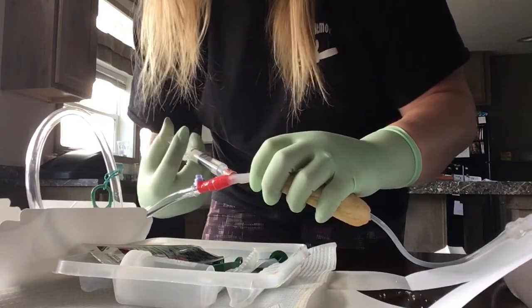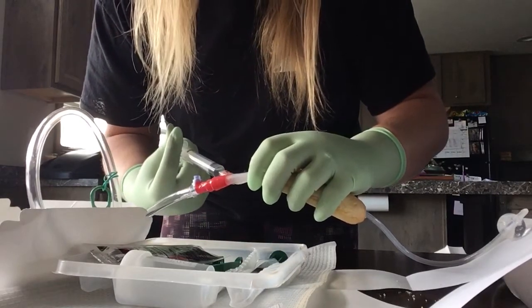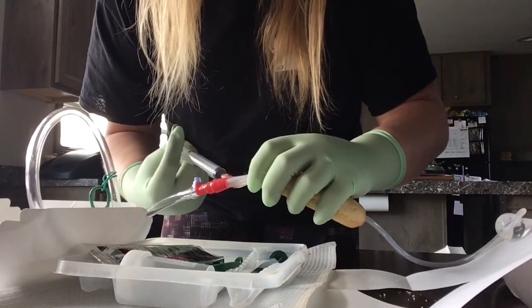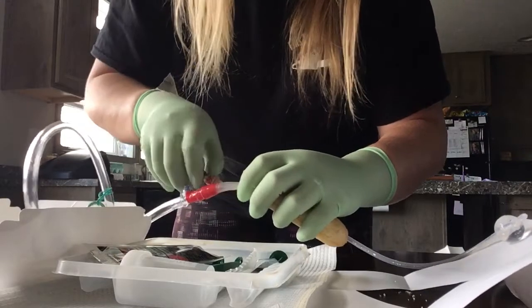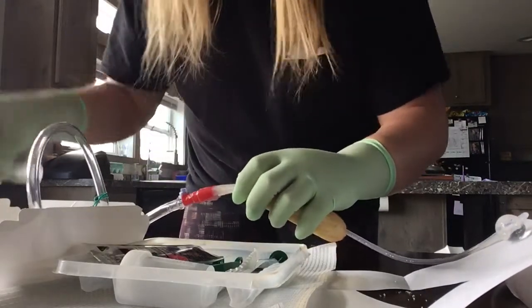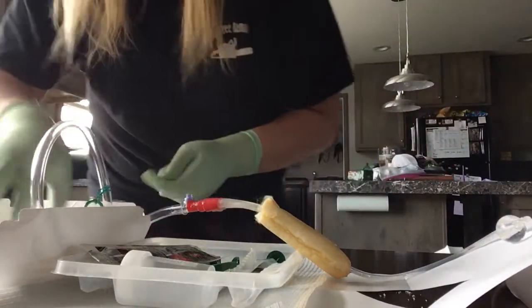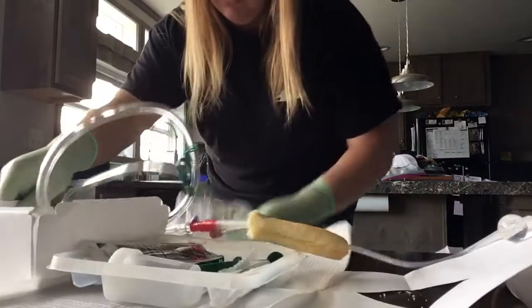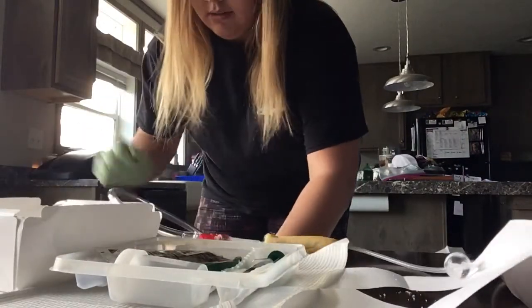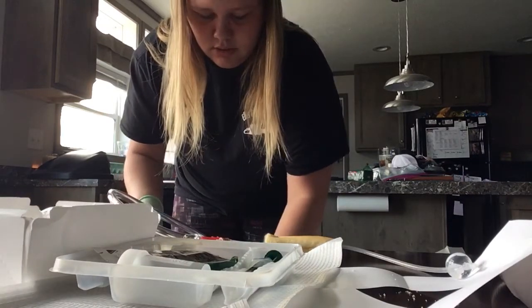Make sure that you have 10 cc's — or make sure you know how much fluid you put in, so that when you take it out you have the same amount. The catheter is good to go. Take your bag and clip it down here at the bedside. Make sure the valve is closed on the bottom. And that's pretty much it.